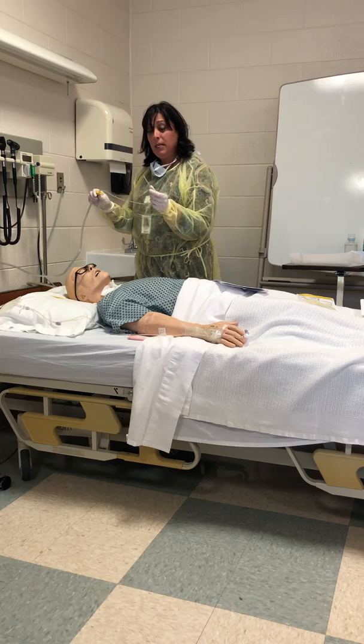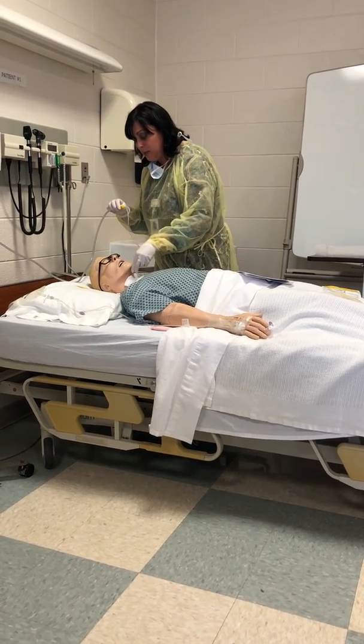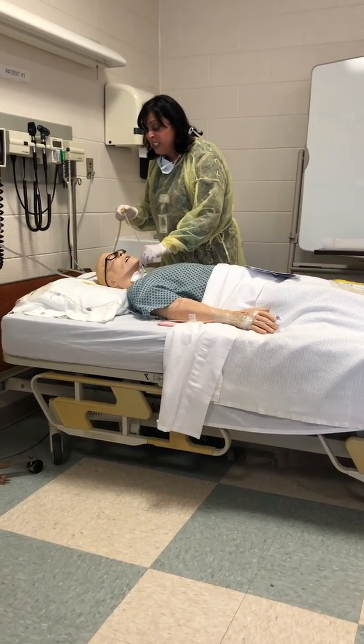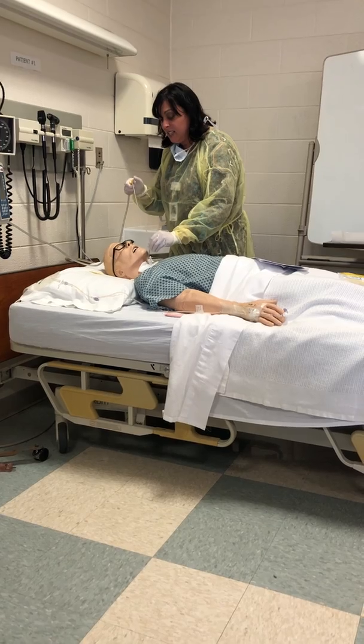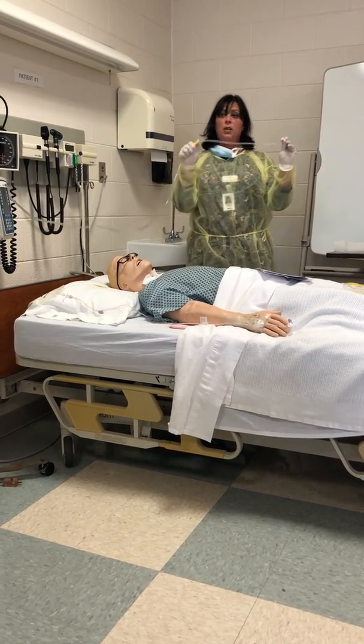Okay, more than the tip is going in. It's all going in. Okay, you ready? Me too. So you go in. Good. Oh yeah. So you go in and you hit resistance. He's coughing. So I'm twisting, suctioning intermittently, doing this. I'm frozen. All right. Good. Stop. Good.